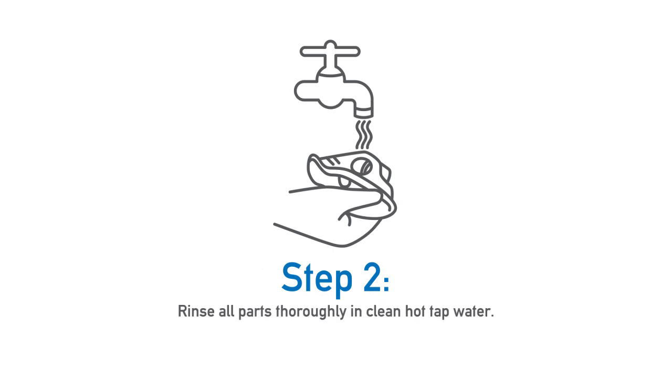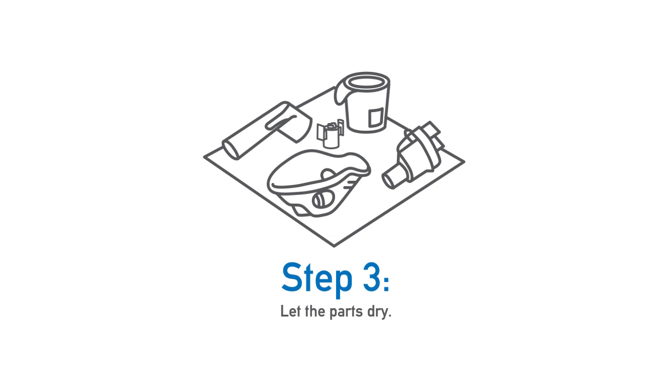Then, rinse all parts thoroughly in clean, hot tap water. And last, let the parts dry.